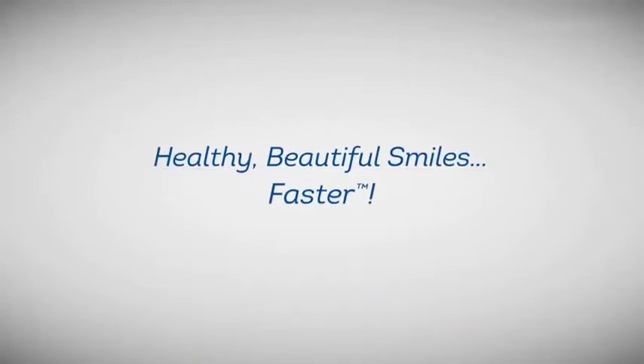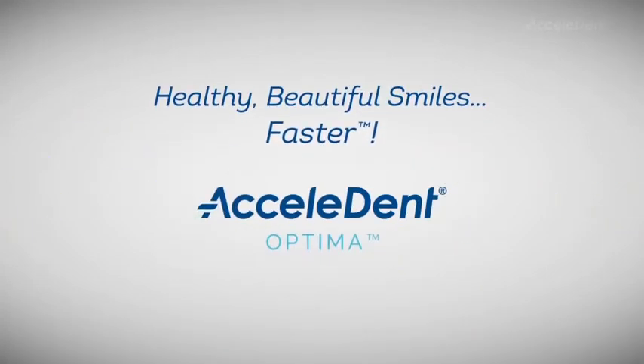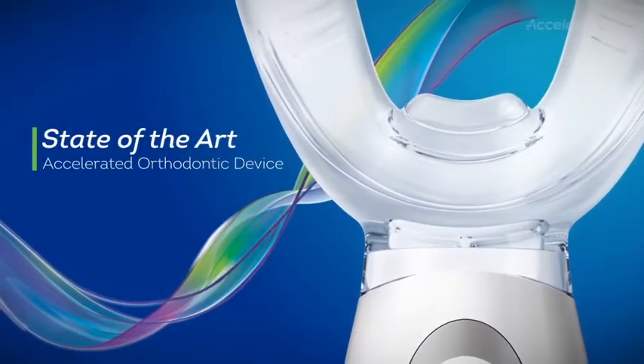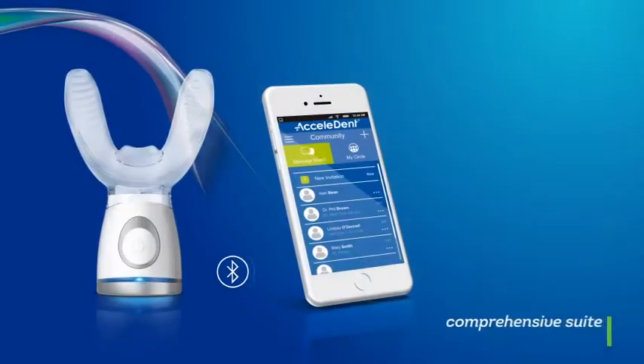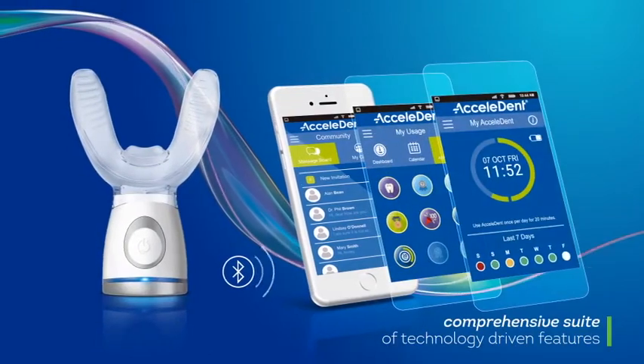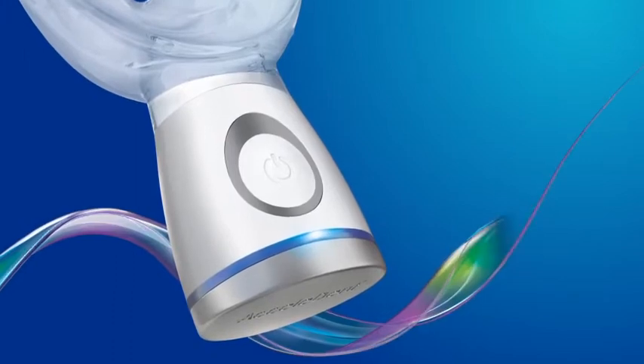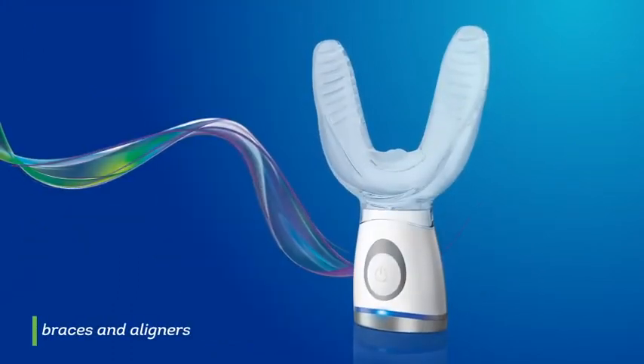Healthy, beautiful smiles faster with AcceleDent Optima. AcceleDent Optima is a state-of-the-art accelerated orthodontic device with a comprehensive suite of technology-driven features. It is intended for use during orthodontic treatment in conjunction with appliances such as braces and aligners to help facilitate tooth movement.